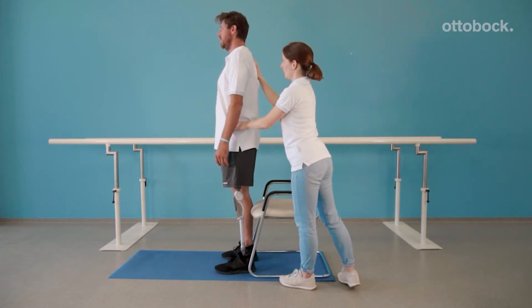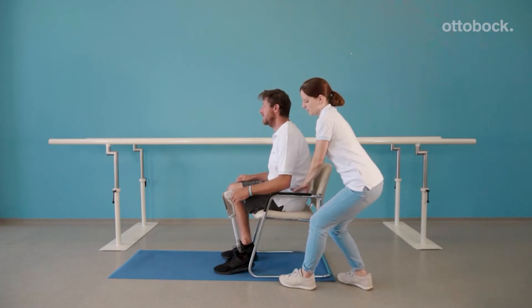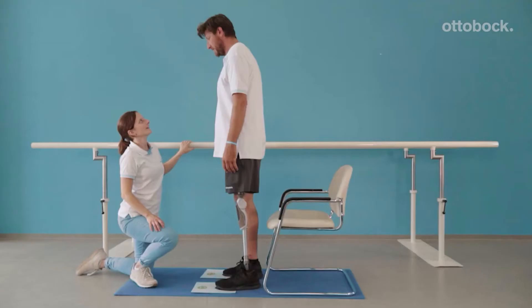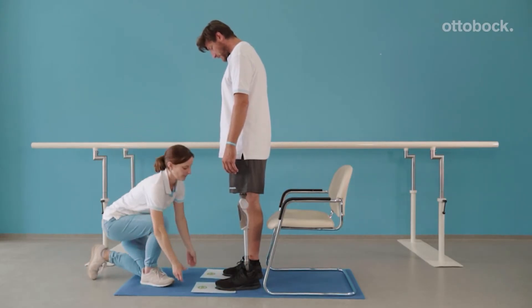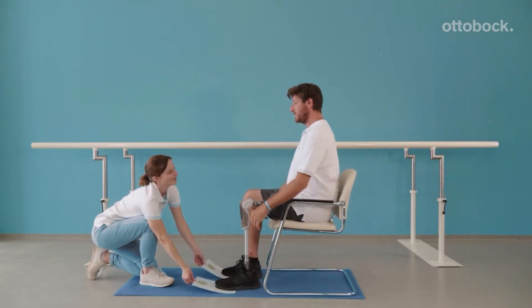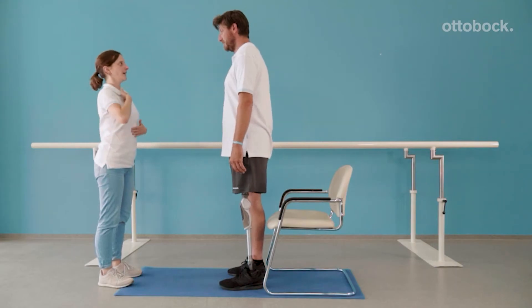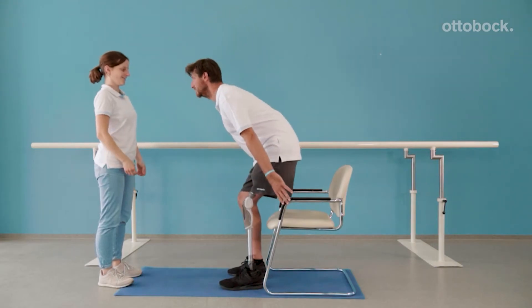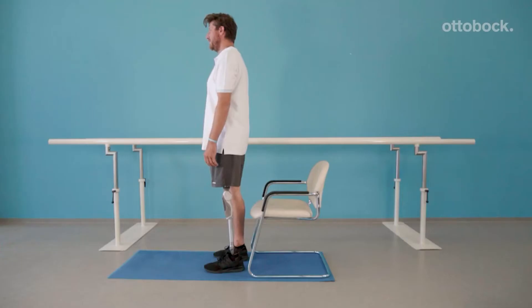The pelvis should symmetrically flex as our model sits down. Use two cards to test if weight is evenly distributed on both legs. When the weight is evenly distributed, the therapist cannot pull the piece of paper away while our model is sitting down. When our model is confident enough, he should practice sitting without assist, and the therapist can correct as necessary.